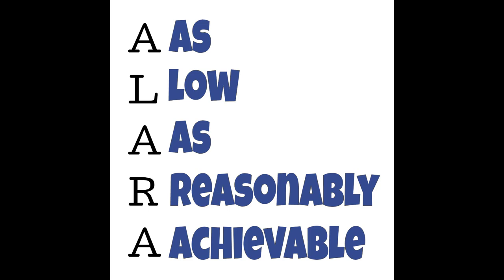Now, most of our modern systems really don't allow us to change the power very easily. Often it's kind of buried in some different menus or under some different knobs, and really it's not going to let you change it to an unsafe or dangerous level. One of the biggest ways that we can pay attention to what power we are using is using the correct preset. Presets are usually programmed into an ultrasound system that kind of gives us a good starting point.